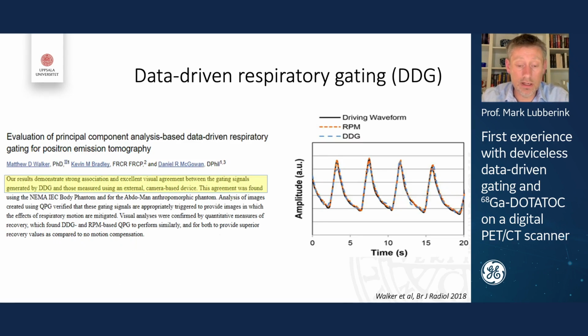Matthew Walker and colleagues in Oxford have done a lot of testing to validate this method. For example, here using a phantom that was moved inside the scanner using a driving waveform shown by the black line in the graph here on the right hand side. And as you can see, the motion detected by the respiratory motion platform and the data-driven gating is virtually the same. So the data-driven gating picks up the motion of this phantom very well.